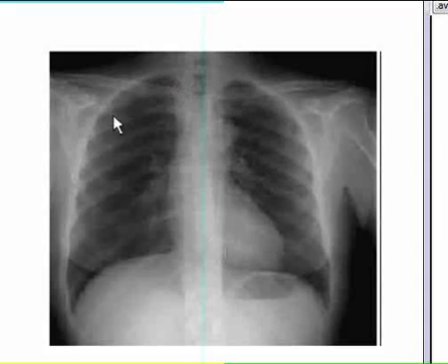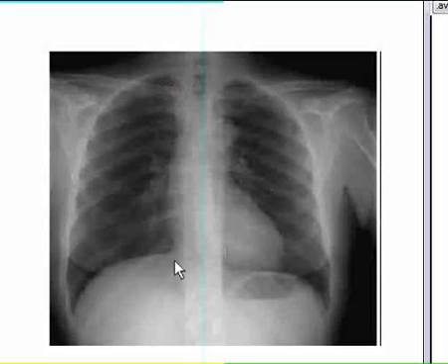Right apex here. Right costophrenic angle. Right cardiophrenic angle.